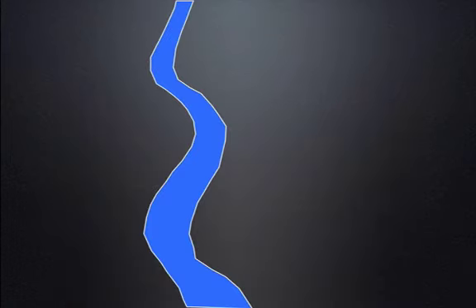I like to think of a river when it comes to the IVC. And I think that's the best way to illustrate it. Here we have a river that is flowing along and well confined within the edges of that river. Now, sometimes that river may flood and the water may extend beyond the margins of its shoreline. This would be consistent with a plethoric IVC.